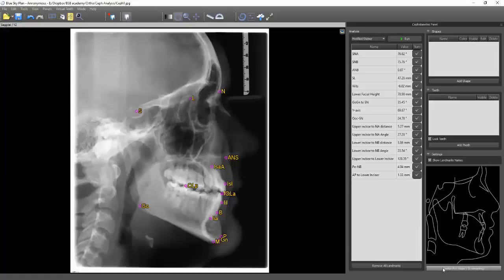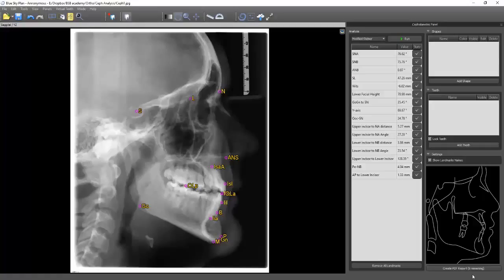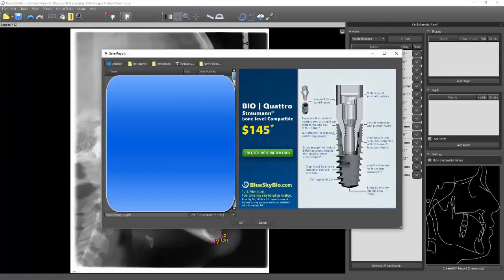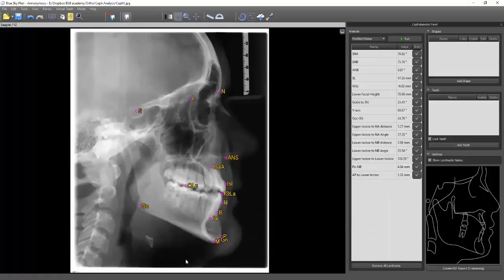When you're all done, go ahead and hit Create PDF. One thing you'll notice is when you buy your licenses for your traditional guide planning, this will essentially take up one half of one. So when I opened up my software and went to export — if I was going to export a guide, it would tell me I had four. But because we're doing CEPH, I have eight; it just doubles the number. So if I export one, I'm down to seven, which means if I have guides, I only have three and a half. That will explain why you have a half value at times. So we're going to go ahead and hit Create Report, save it, and it is saved.